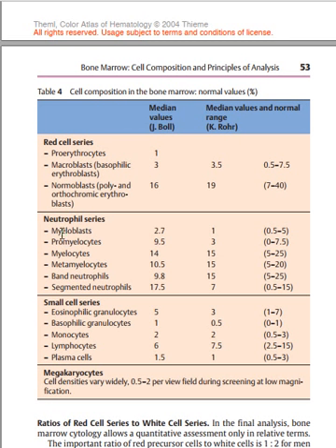So these are the different precursors. We start with the myeloblast, then we have the promyelocytes, the myelocytes, the metamyelocytes, the band cells, and the segmented neutrophils, or the segmented eosinophils, or the basophils, depending on which series you are working with.